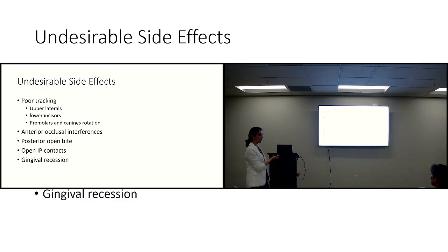So price of straight teeth, you'll have food get caught everywhere, and then you'll have black triangles. Doesn't sound very appealing, does it? Yes? So are you saying for the open contacts that you're usually doing refinements to tighten them? Yes. Okay. Every time, without exception, unfortunately.